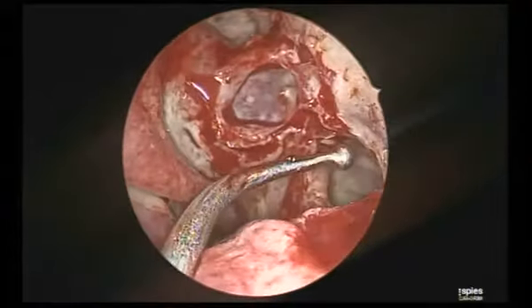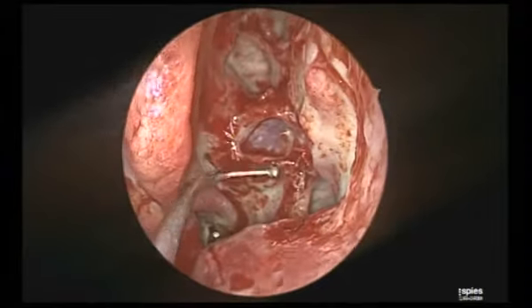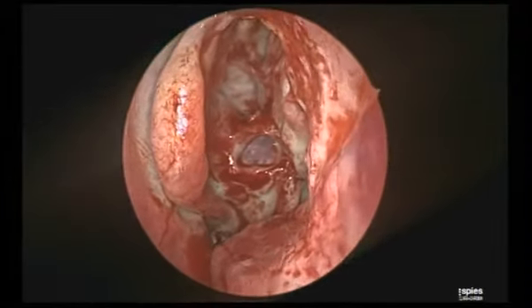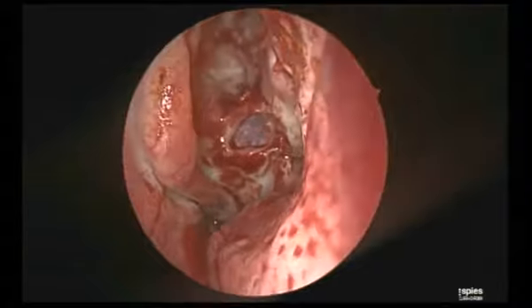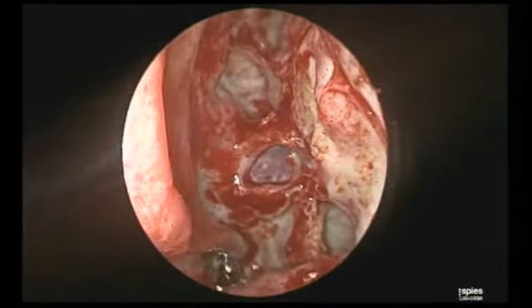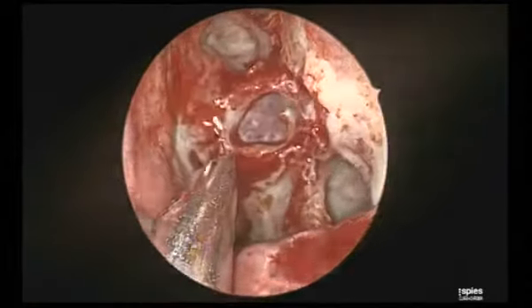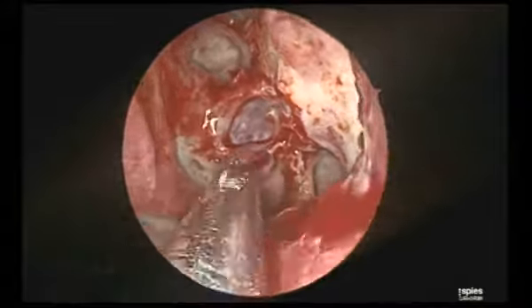The moment I find a maxillary line, this is a very, very important landmark for me to work behind. Because what I need to know before doing posterior ethmoidectomy is my posterior limit of posterior ethmoidectomy, so that I don't accidentally enter into the sphenoid sinus. So, first of all, you need to enter into the ground lamella, and here my maxillary line is important.